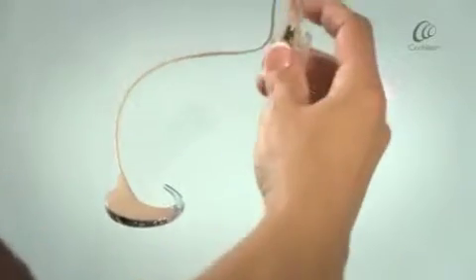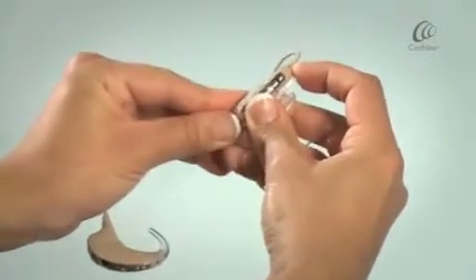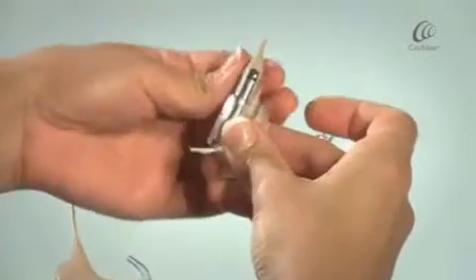To detach, use your thumb to slide the battery module out of the case.